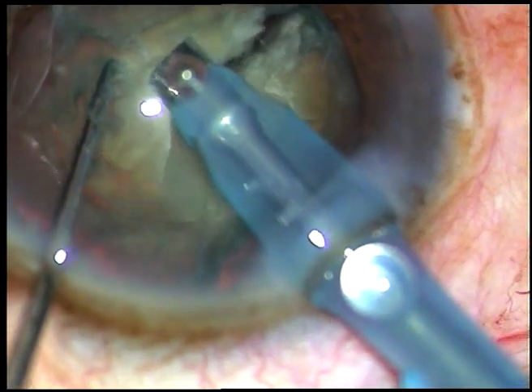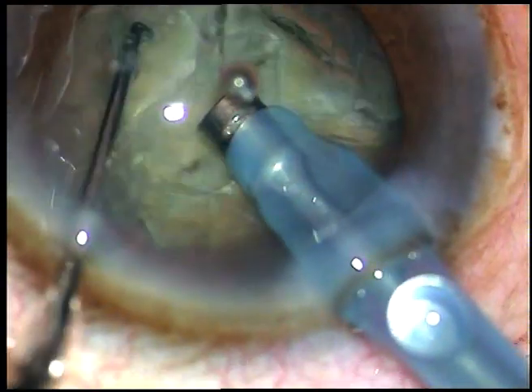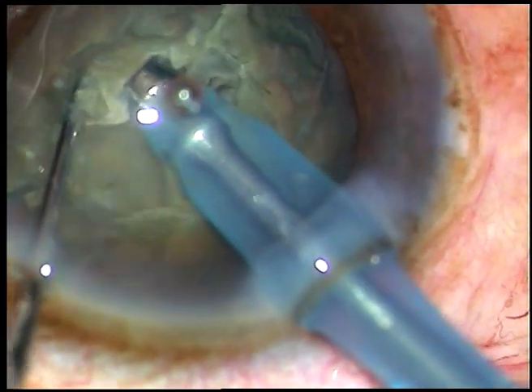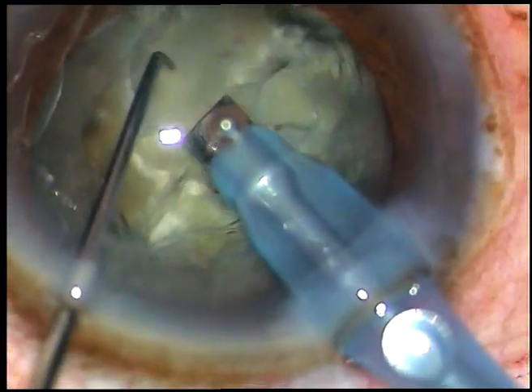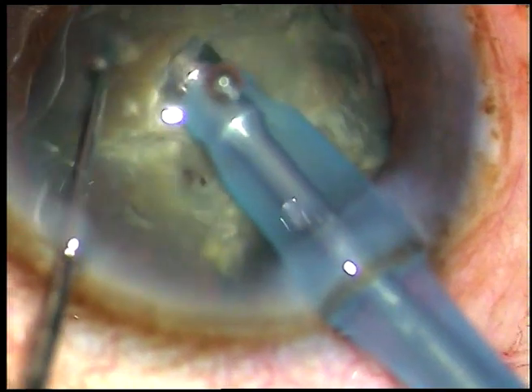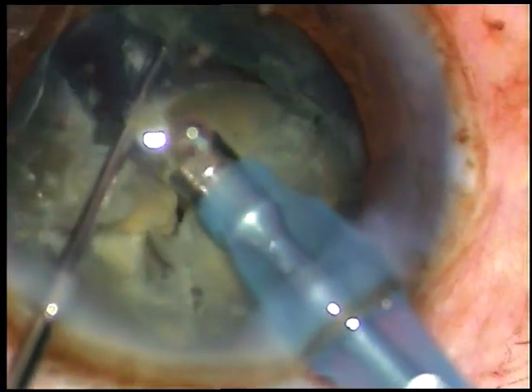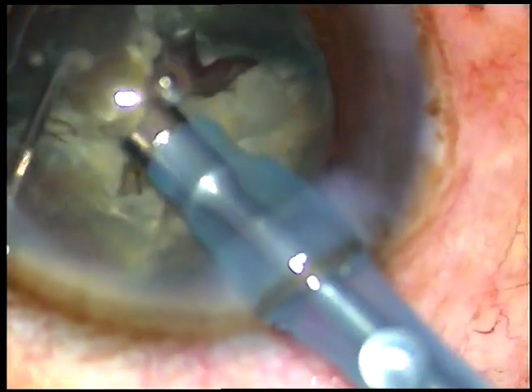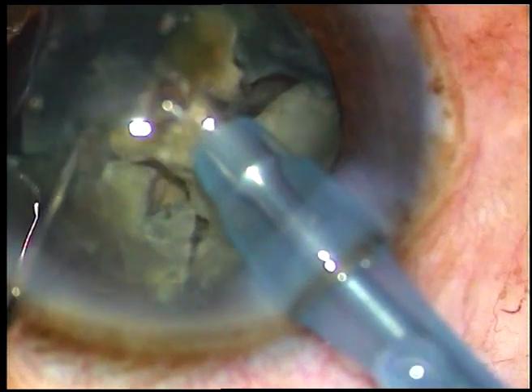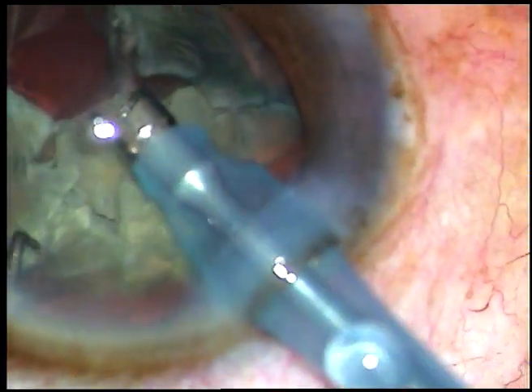This is the second chop. My strategy here is to chop the nucleus into as many fragments as possible because there is zonular weakness, and then I will start emulsifying each nuclear fragment. I have started catching hold of each individual nuclear fragment and emulsifying it.